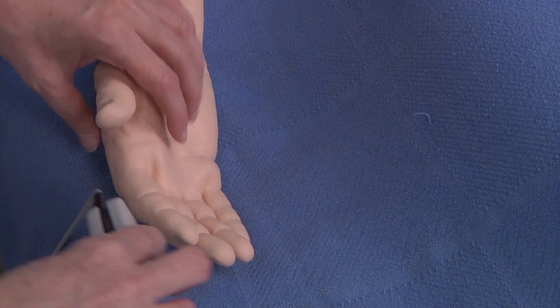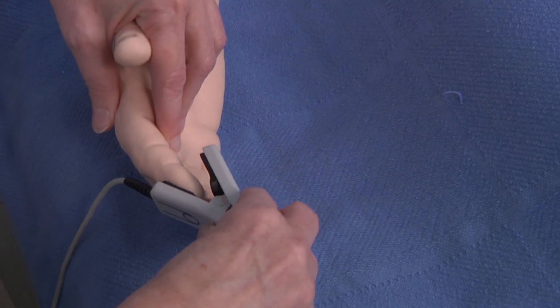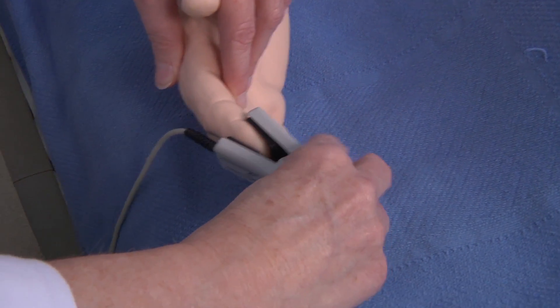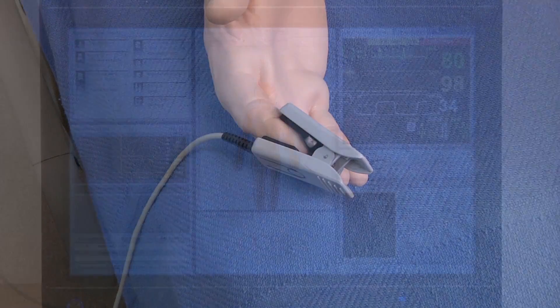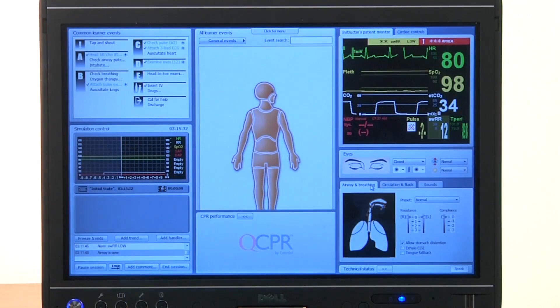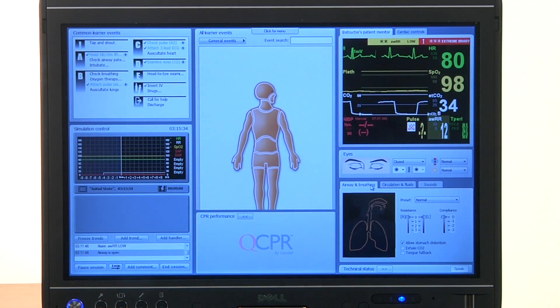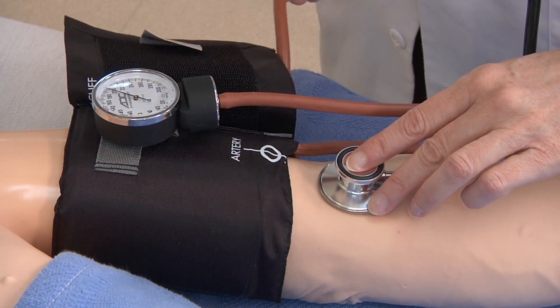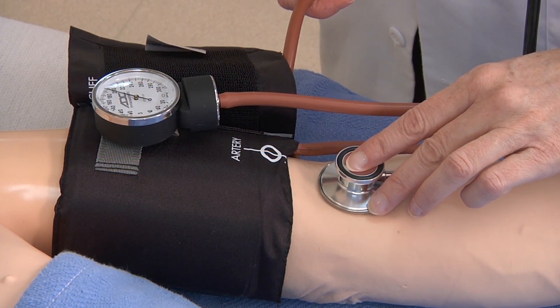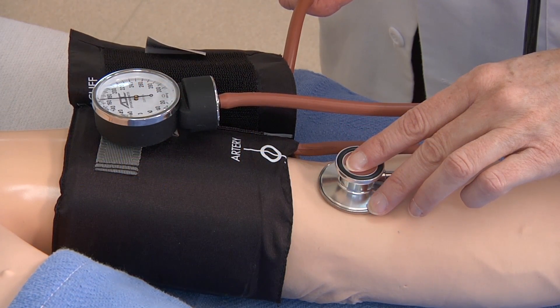The oxygen saturation probe can be attached to the finger and give waveform feedback on the patient monitor. The patient monitor also displays SimMan's blood pressure, which can be taken manually by auscultation or palpation.